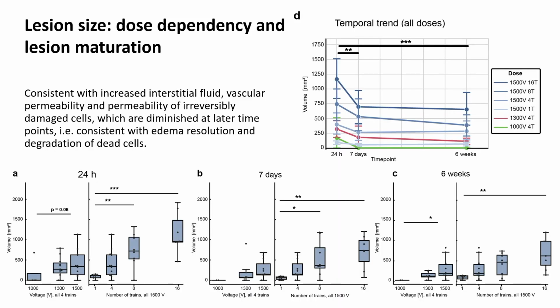The reason why we want to do that is to show that you do not increase indefinitely. From 1 to 4, it's 4 times. From 4 to 8 is 2 times. From 8 to 16, 2 times. Do you see 4 times, 2 times, 16 times increase? No. Okay, so there's a saturation point.